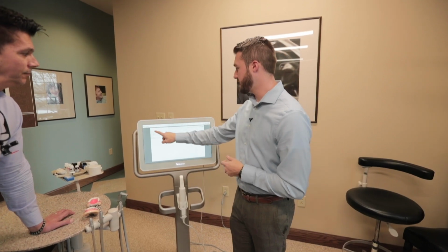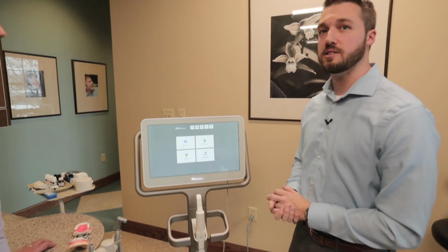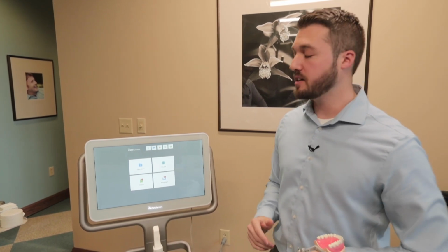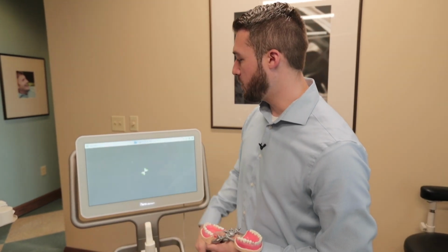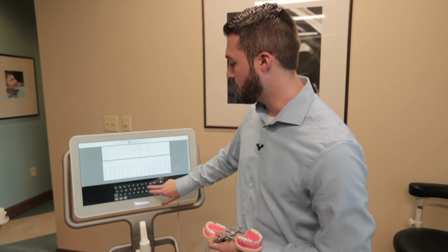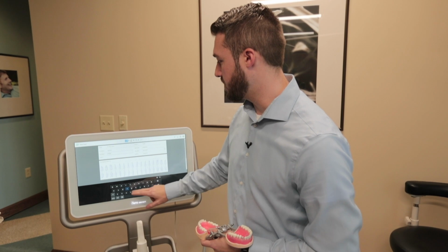All right, so let's touch base a little bit on our restorative workflow. Sound good? Yeah. Great. All right, so now we're just going to do a single crown on tooth 19 here. I'll go through the simple workflow and just the ease of use of the iTero scanner. So we're going to go in and set up a new patient. We're going to pick their first name. I'm just going to make this one up. I'm just going to type in a bunch of letters here.